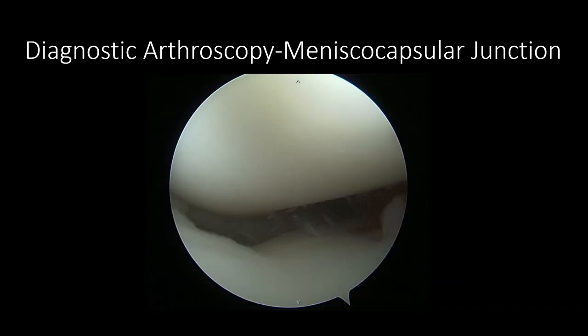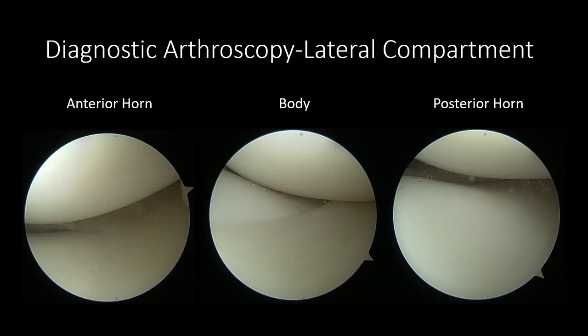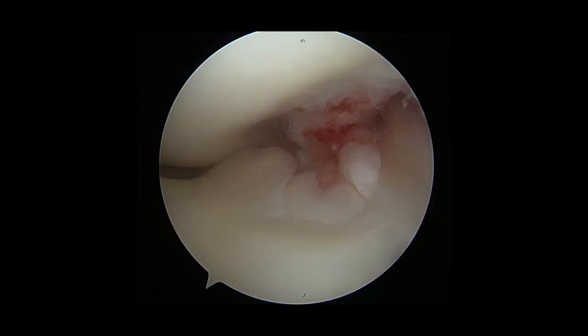Complete separation of the meniscocapsular junction was seen through the inferolateral portal. A 70-degree scope was used to view fraying likely consistent with a posterior medial tear through the notch. During the diagnostic arthroscopy, the lateral compartment was also visualized, demonstrating an intact and stable lateral meniscus. This patient was also noted to have an anomalous insertion of the anterior horn of the medial meniscus at the ACL. The decision was made intraoperatively to neglect this finding.